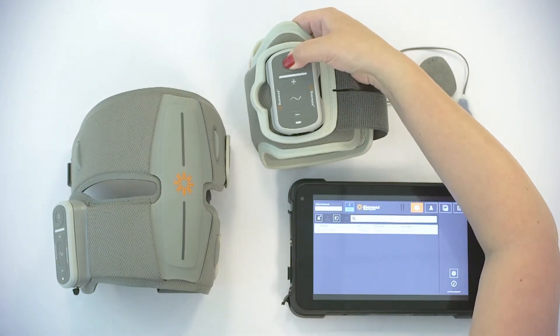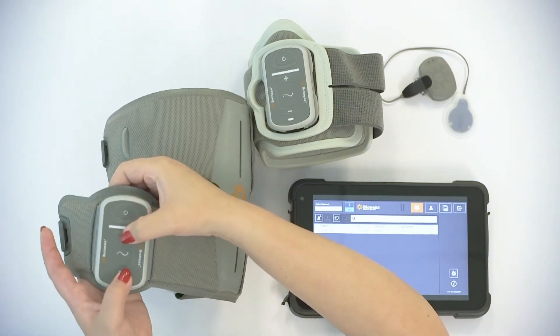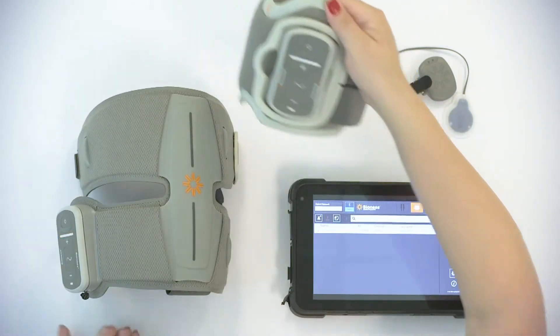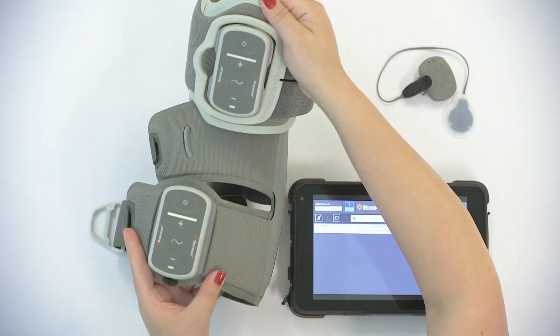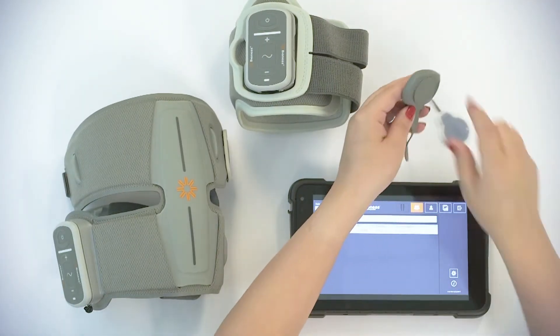First, pair the thigh cuff with the lower cuff. Next, pair the foot sensor with the lower cuff.